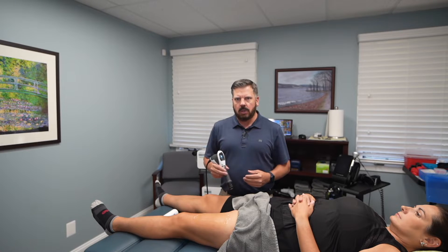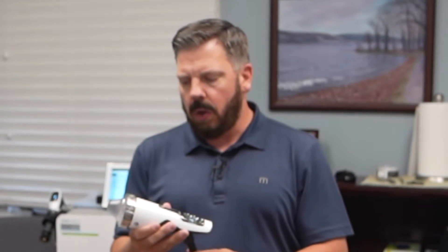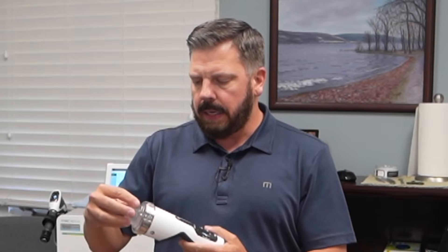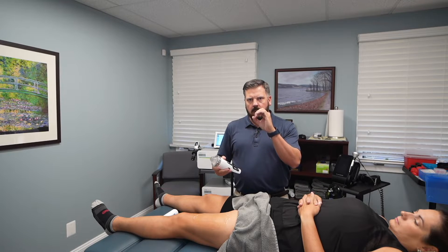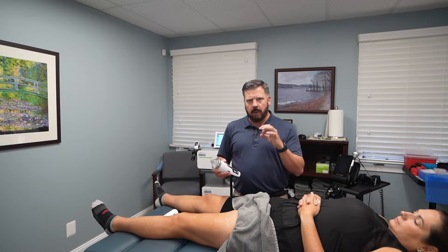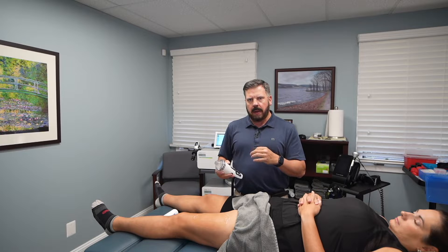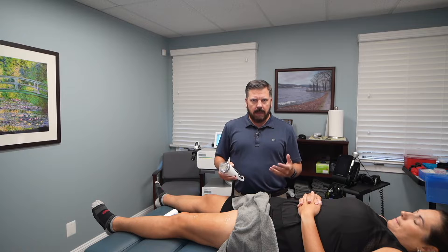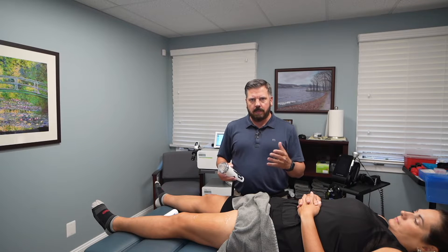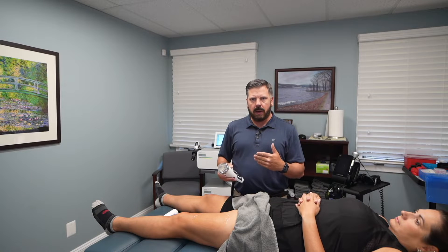We go up and down scanning the tissue, then work and loosen up that spot. This is what the focus shockwave head looks like — it has a tip where the shockwave comes through. This is a very narrow type of treatment, going to more pinpoint spots. When we get over a problem spot, I hold it on that area until we go through the cycle of treatments. I'm going to ask the patient where that tender spot is, and when she says that's the spot, that's where I hold it.